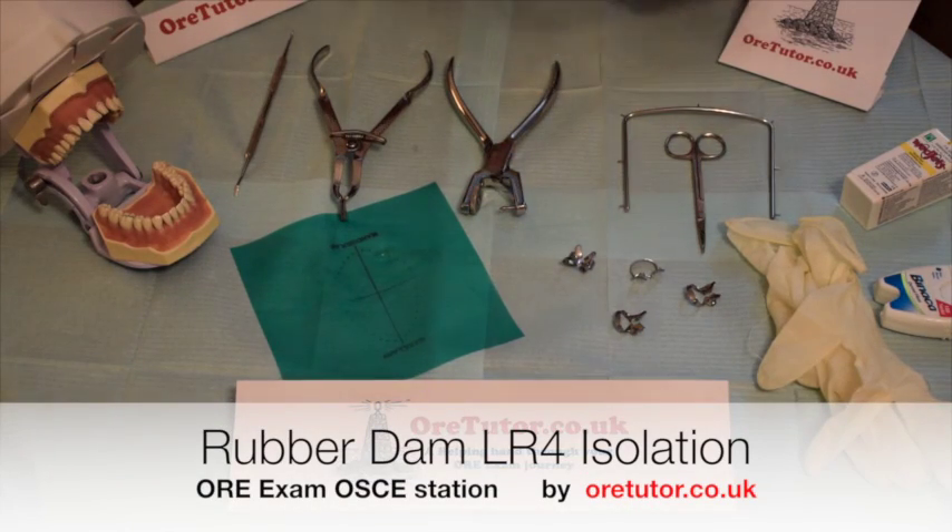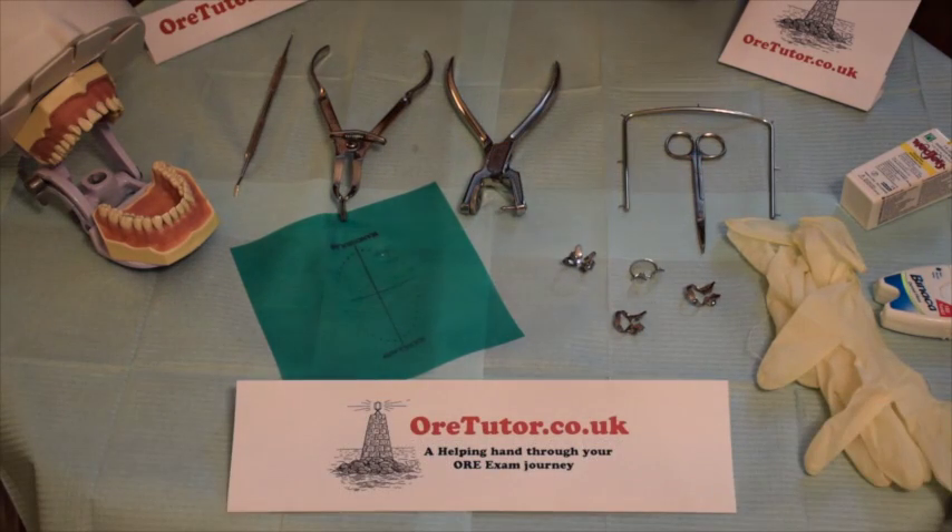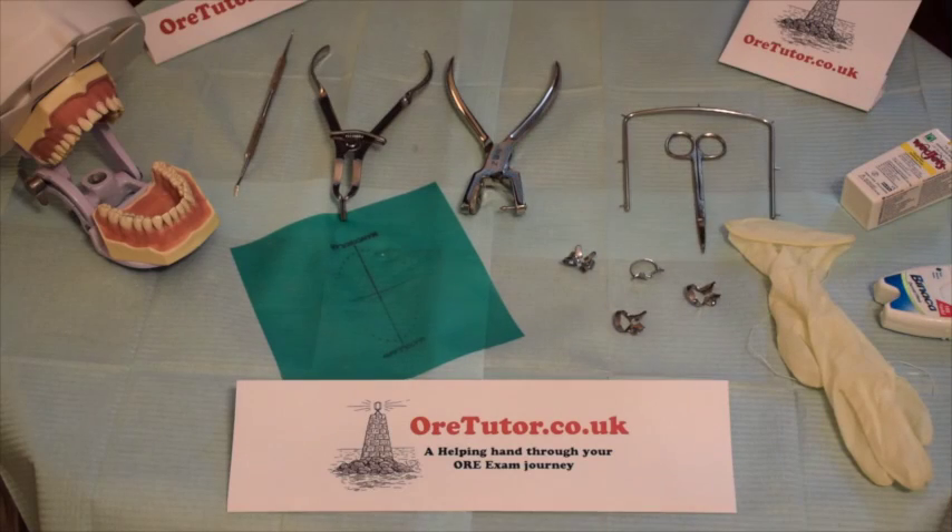Today I'll be showing you the OSCE of how to isolate a mandibular right first premolar using a rubber dam for endodontic treatment. First of all, you need to act as if you're dealing with a real patient in a real practice. So when you start your OSCE, tell the examiner that you'll wash your hands, put on your goggles — don't forget your goggles — and put on gloves.